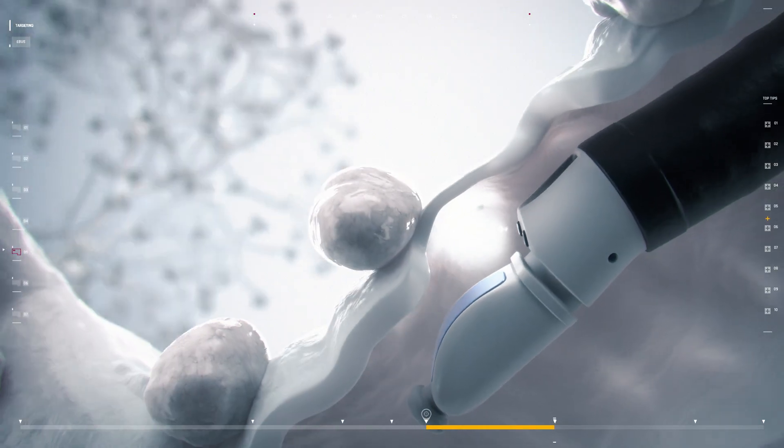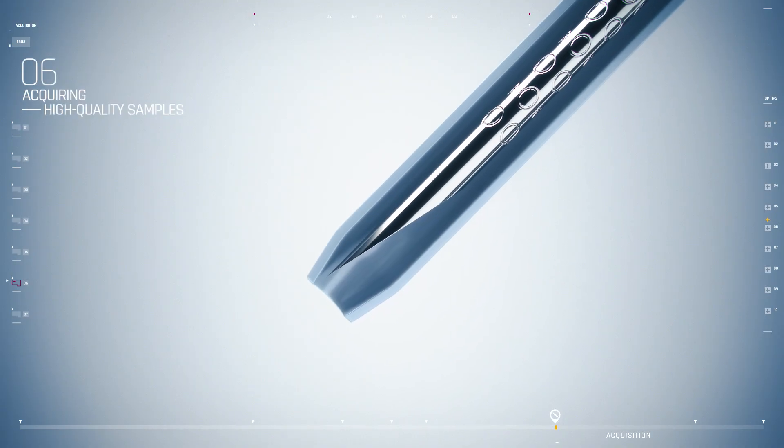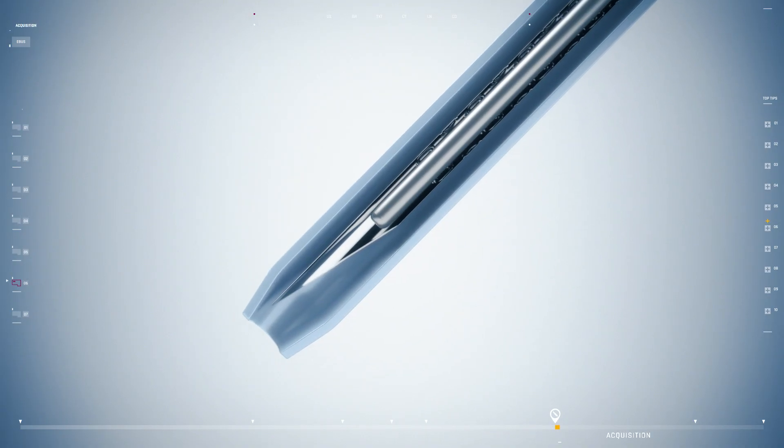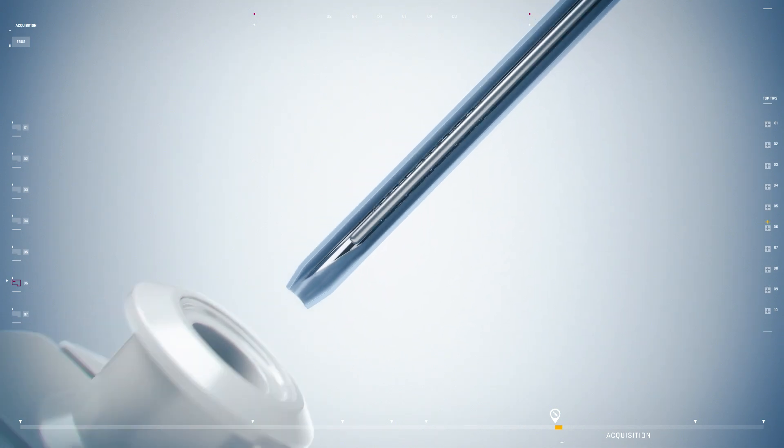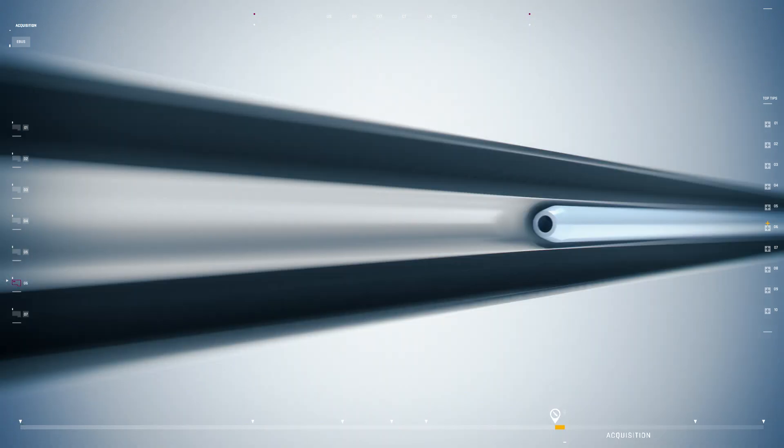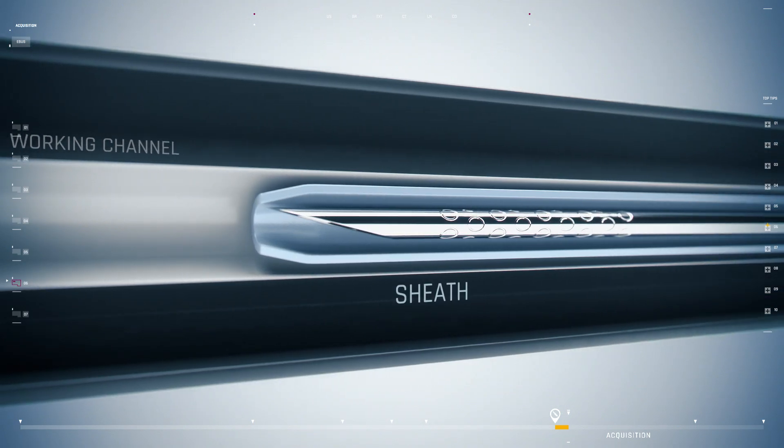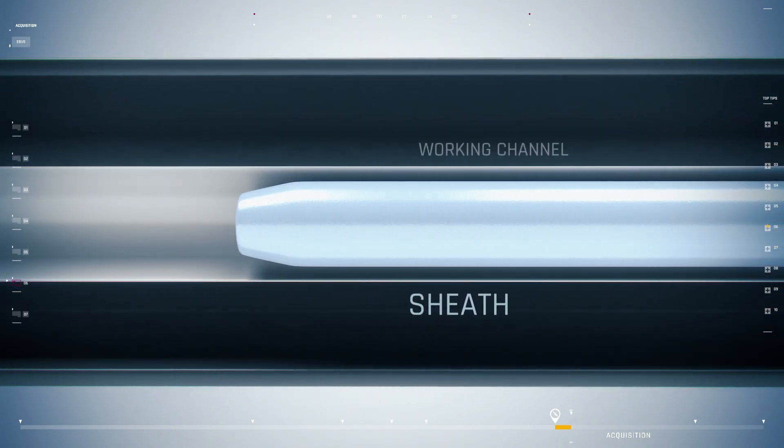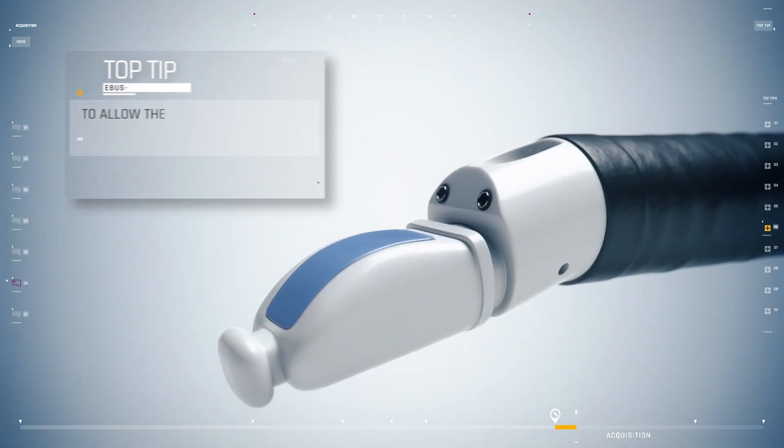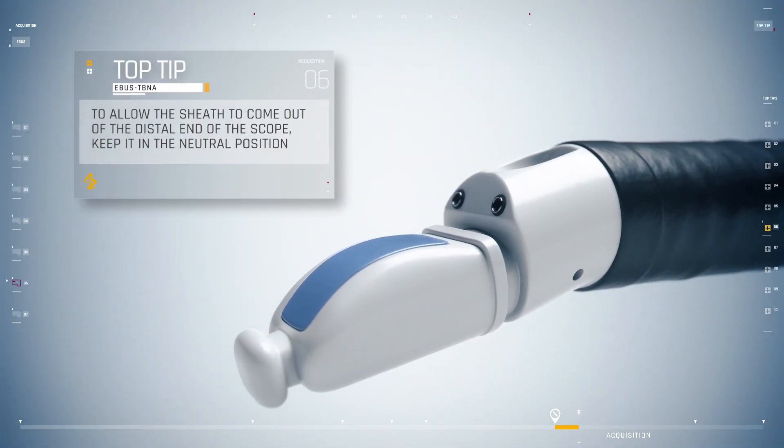After confirming the site to be sampled, the TBNA needle equipped with an internal stylet is inserted through the working channel of the EBUS bronchoscope. The needle should remain within the sheath during passage through the working channel in order to prevent damaging the bronchoscope.